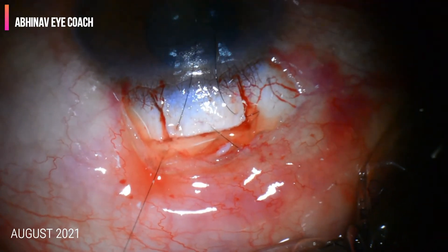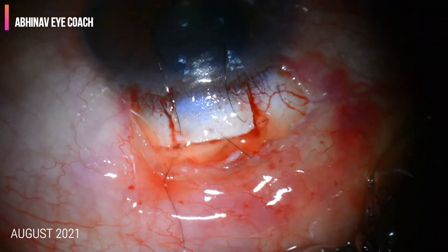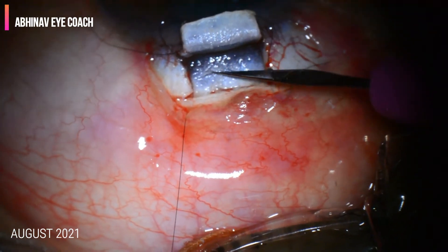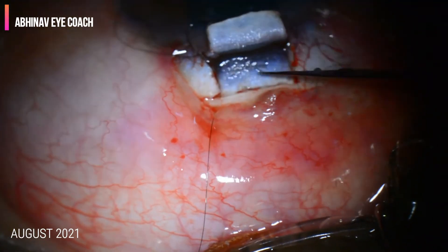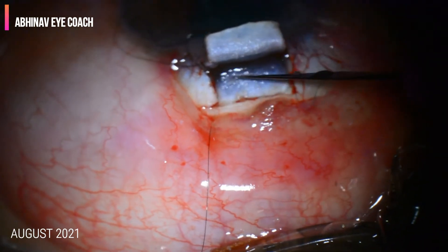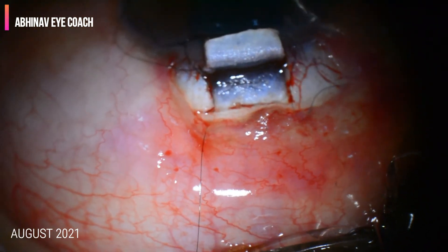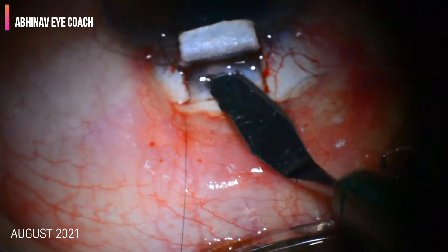Immediately after entering the anterior chamber after sclerostomy, there is a sudden collapse. To avoid that, we should place these pre-placed anchoring sutures. With a very sharp blade, we incise the area planned for the scleral block, place a single incision, and enter the anterior chamber.